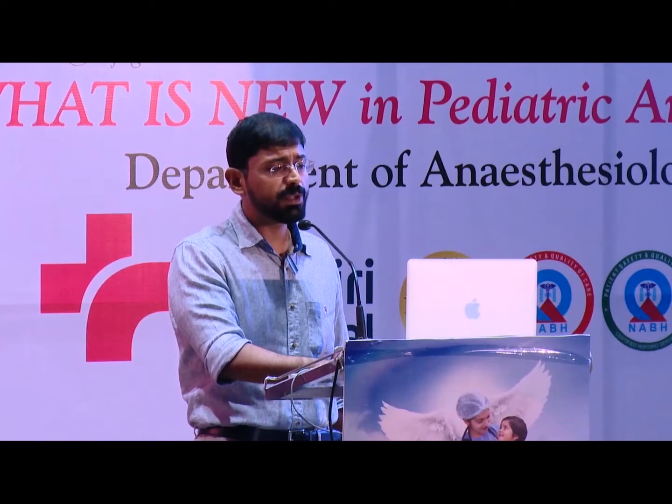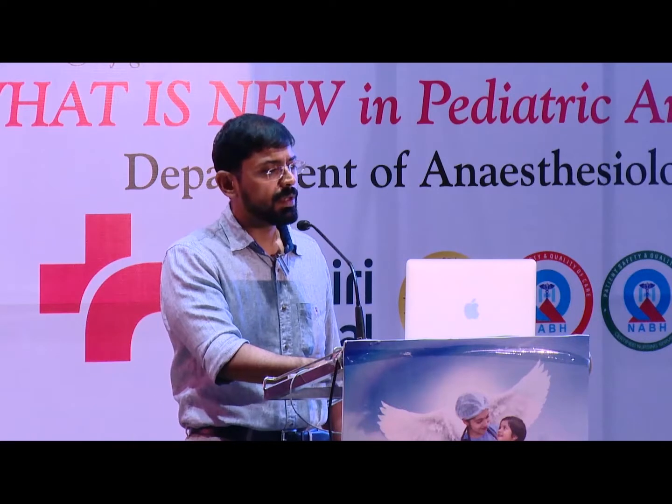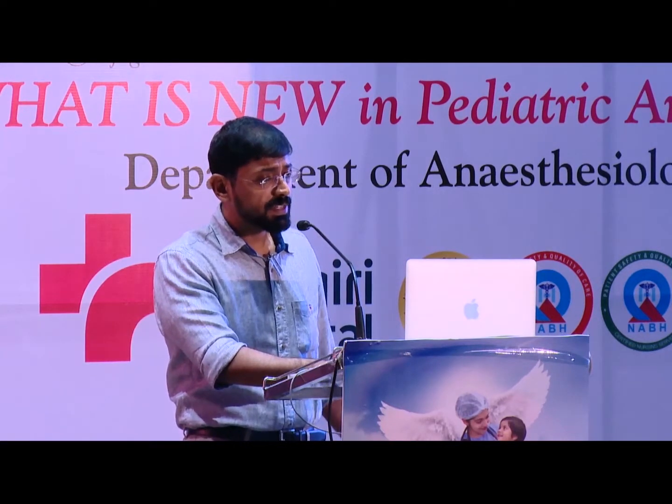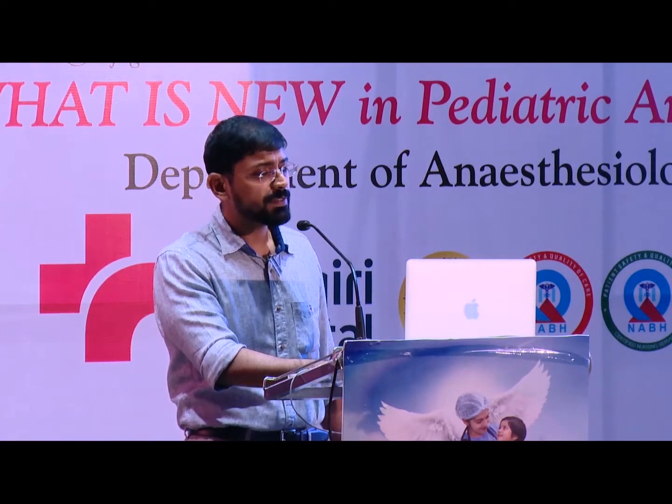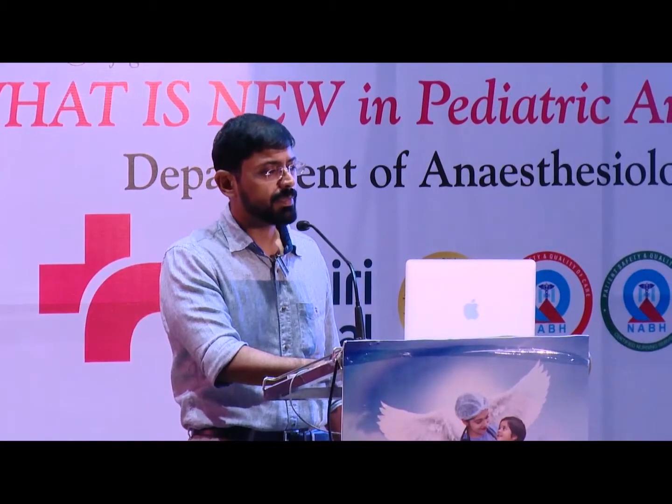What is too low a frequency? Any value lower than 7 is too low. Clues to a high MAP in the X-ray would be looking for flattening of the diaphragm and also looking for a decrease in the mean blood pressure.